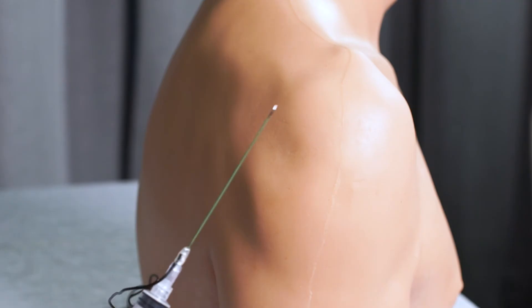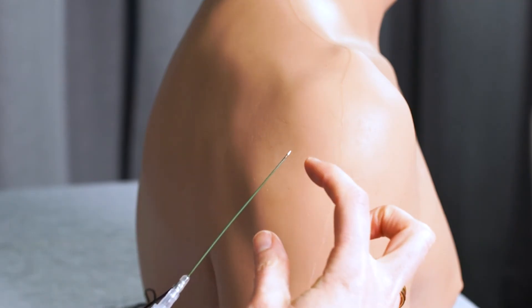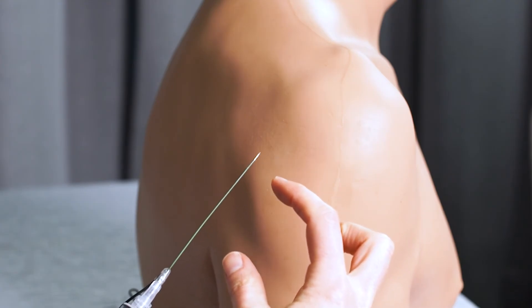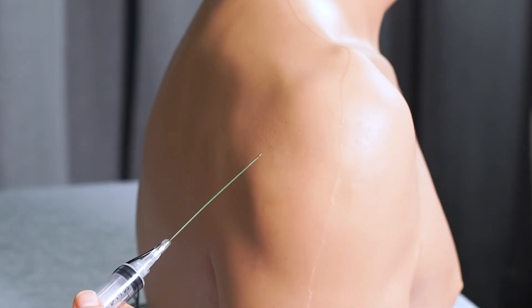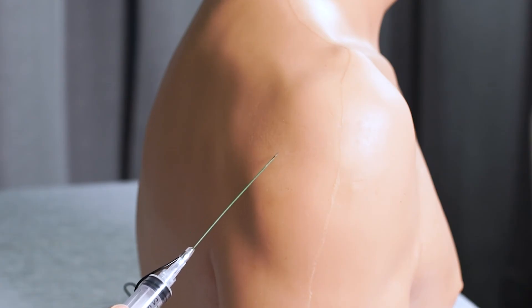You would take your syringe with your needle — this simulator has a long spinal needle but typically my needle would be about an inch and a half, so I'll typically hub it. You want to go quickly through the skin and then advance gradually, heading slightly up and towards the coracoid.